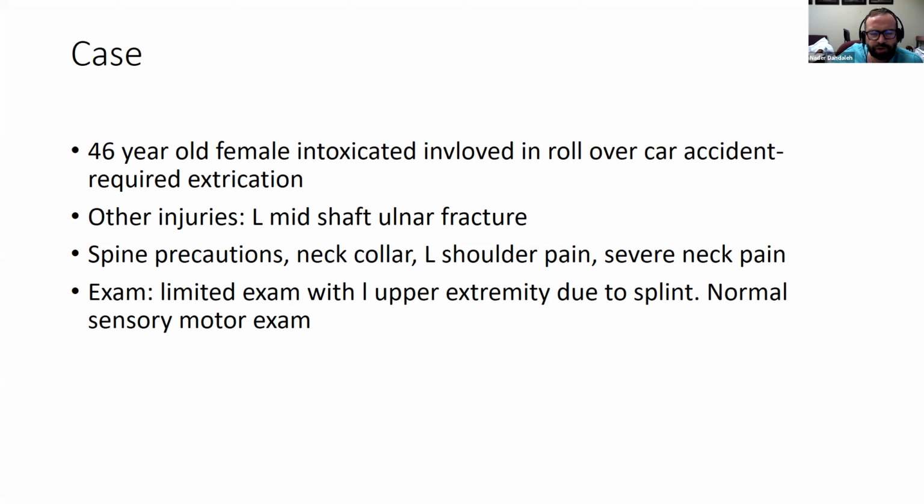Lowest instrumented vertebra: there's no perfect science here, but that's how I treat those patients. With OC fusions, I never stop at C2. I always go to C3.